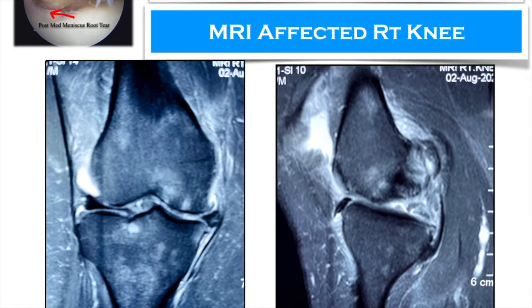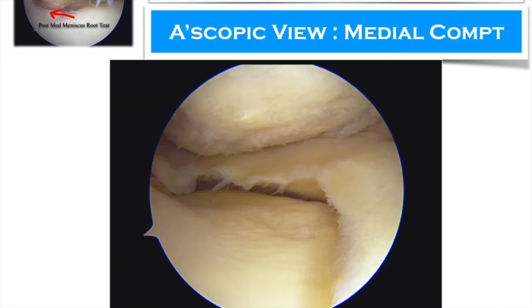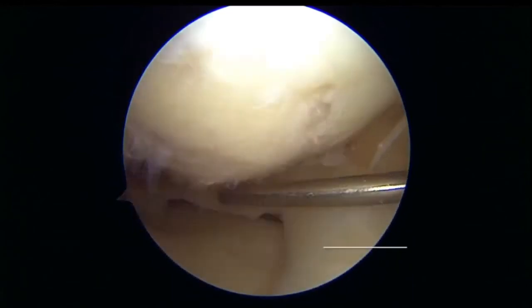On the MRI, it shows extrusion of the meniscus and on the coronal you can say almost like a ghost sign on the sagittal images with a tear. On arthroscopic view, it showed degenerative change in the medial compartment of the knee.